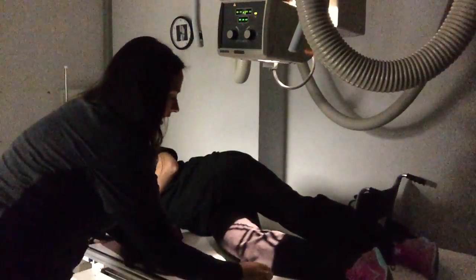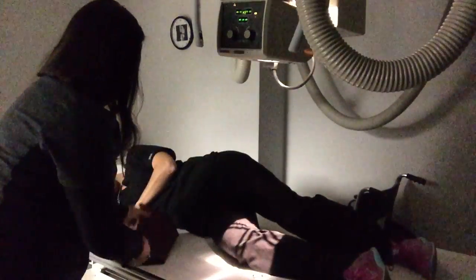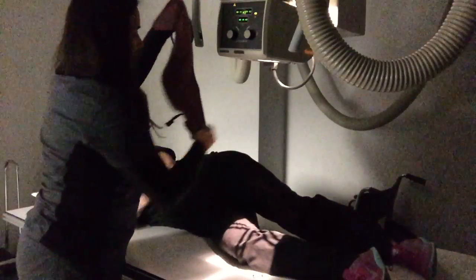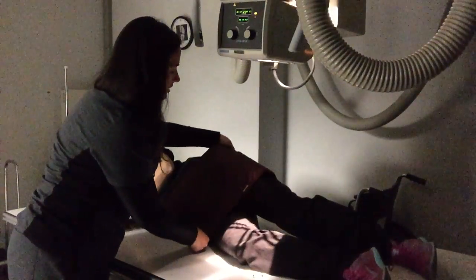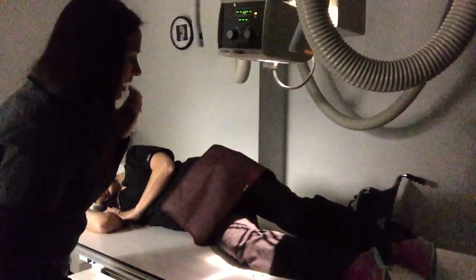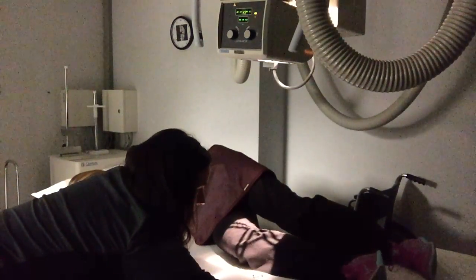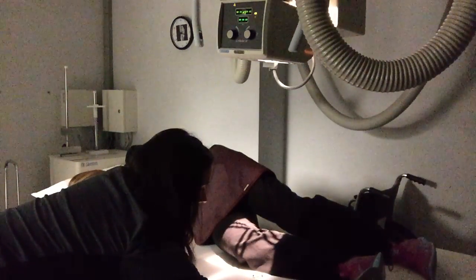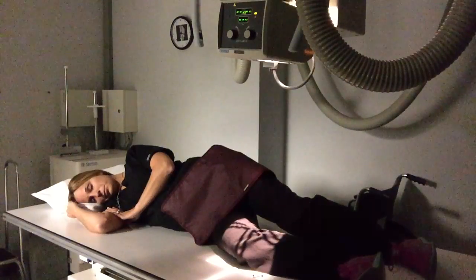I'm going to stick my marker out here in front. And then I'm going to place the shield over her here, making sure that it's really blocking any scatter coming in this direction, because we're still angled at 5 degrees this way. So I'm going to make sure this is covering her now. Also, I like to have my patient flex their foot up again for this projection. It helps hold their patella right in profile here before I'm going to expose at 85 kVp. And that is the two views of your knee.